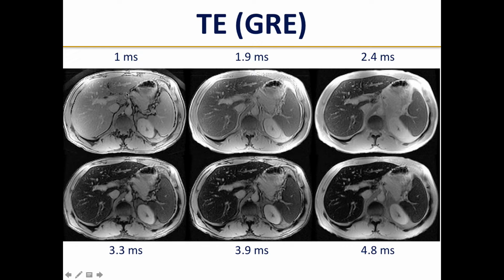We'd see nothing. Now this is a patient that has iron overload in the liver and the spleen, but not the pancreas. So notice that there's lots of signal loss from 1 millisecond to 2. By the time you get to 4.8 milliseconds, notice that the liver and the spleen are black. Notice that the pancreas has not decreased at all. So I will now ask a rhetorical question. What is the cause of this patient's iron overload? Multiple choice question. Is it hemochromatosis or is it transfusional siderosis?